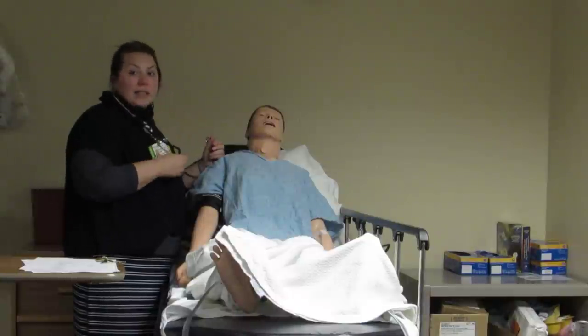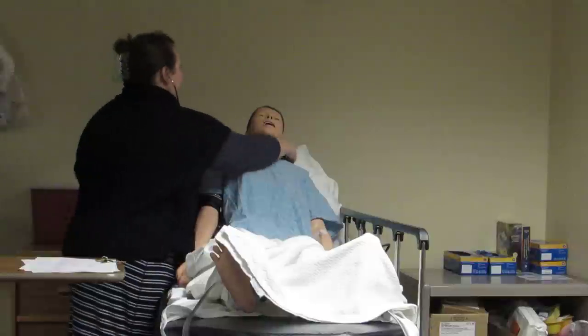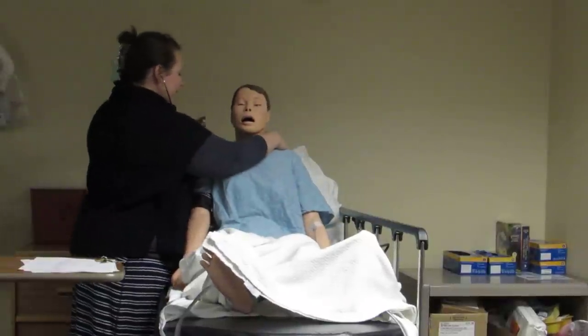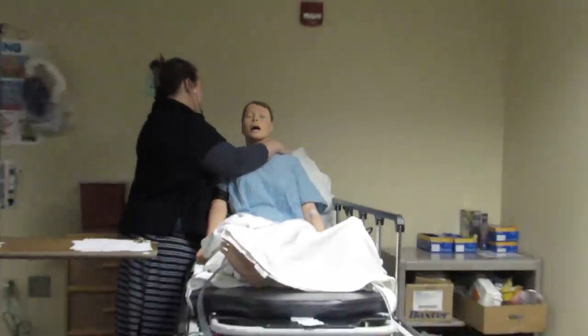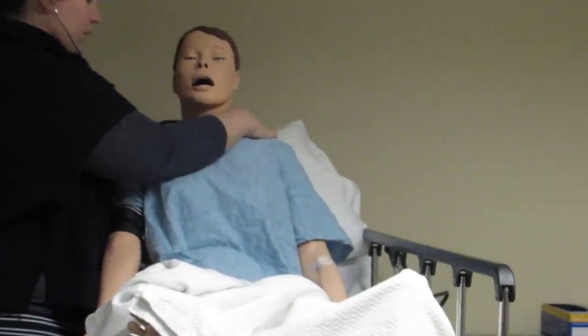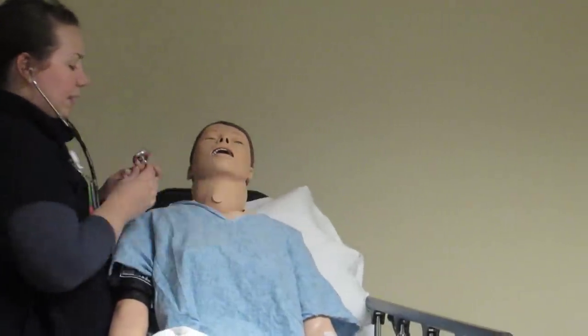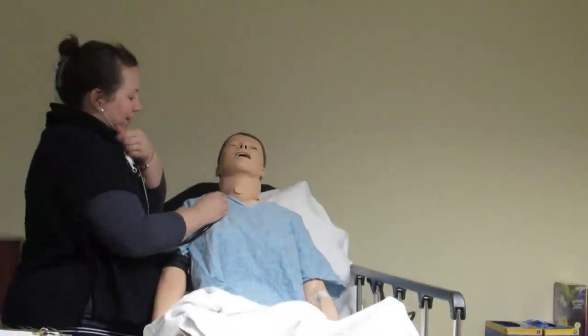Asking them to take a nice deep breath every time I move my stethoscope. So Mrs. Smith, you can just take a nice deep breath every time I move my stethoscope. I'm going to start up at the top, and I move my way down her back. So what I'm doing is going down her back like this.